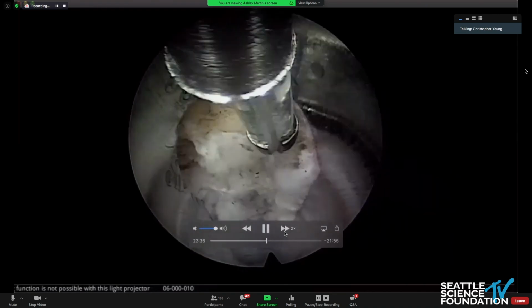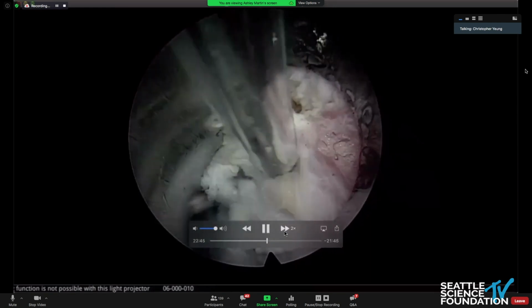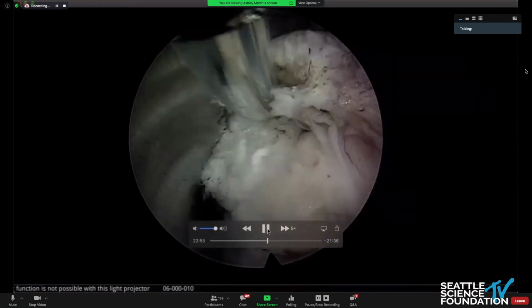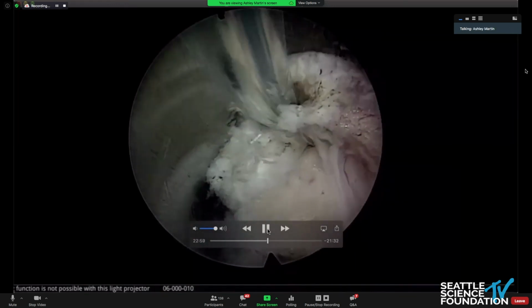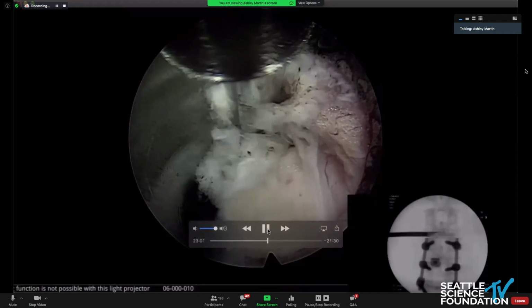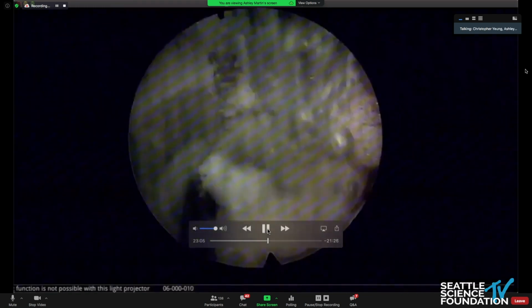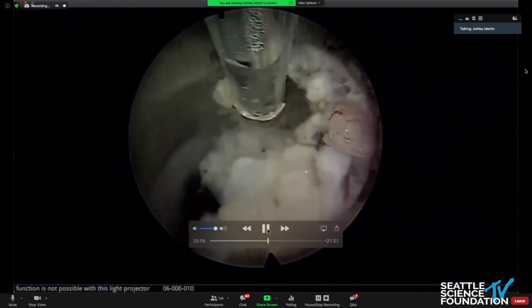Here I'm going caudally now. This wasn't a paracentral herniation, but I'm just trying to demonstrate how you can use this space and just sweep cephalad, caudal, and also dorsal, to make sure there's no pathology in the space. So I don't necessarily need to do that.